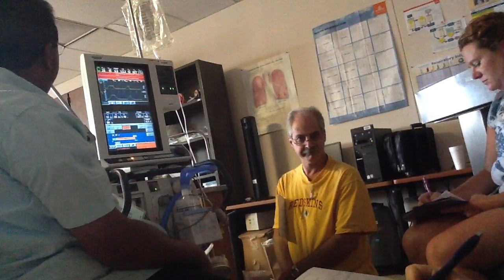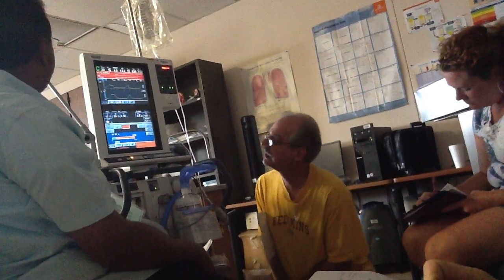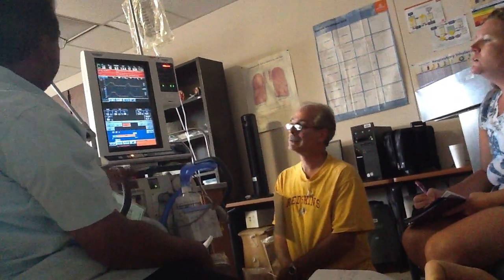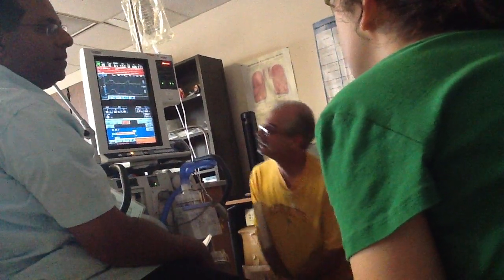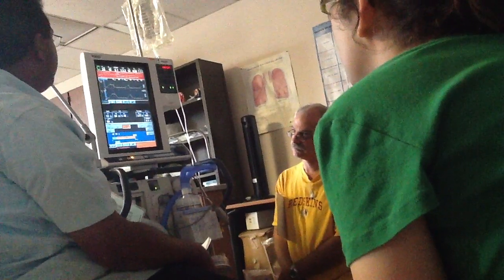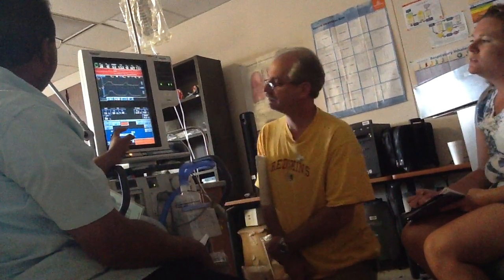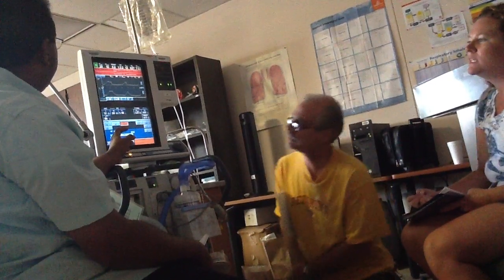So what is it now? Is it locked or unlocked? It's locked on the TE. No, it's unlocked on TE. See that unlock button pointing down? Oh, I see. Yep, you're right. Okay. So it's locked on TE, right? No, unlock it and go back. Now it's unlocked. TE was unlocked.